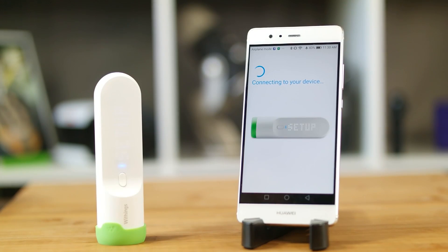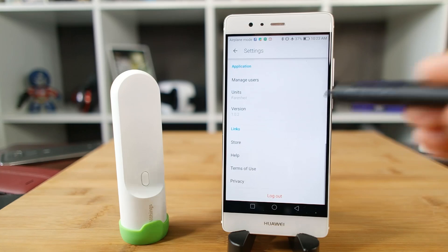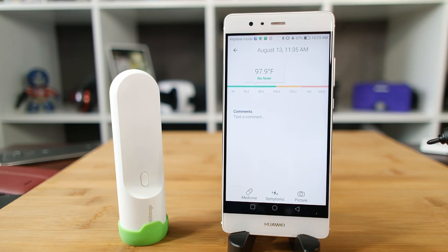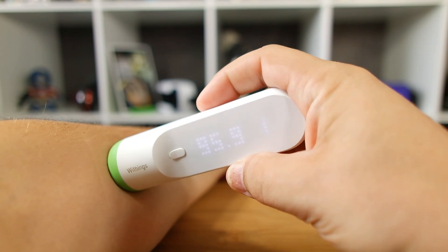I think Thermo is a device that everyone should have in their home. It's easy to use, easy to set up, and also the fact that you can use it with multiple users and tabulate the readings within the home. So this is great if you have a family, if you just have a newborn kid, or even if you're just single. If you have a fever, if your kid is sick, you can collect those results and you can also send them to your doctor.